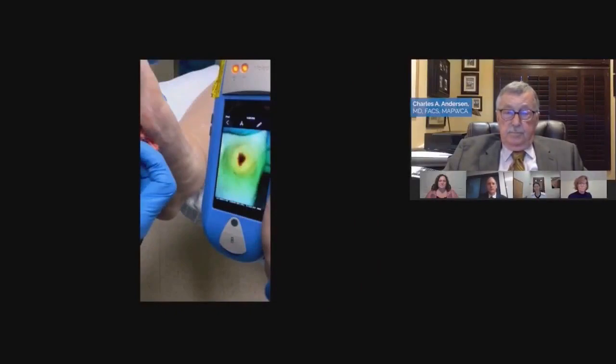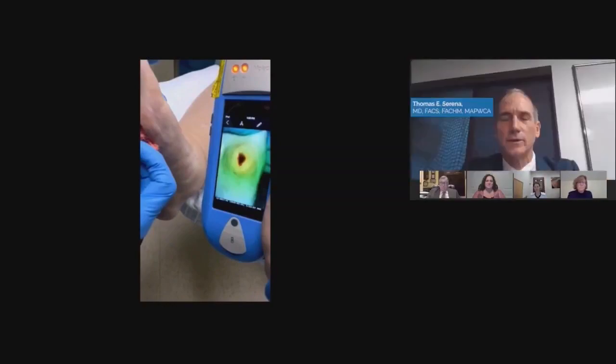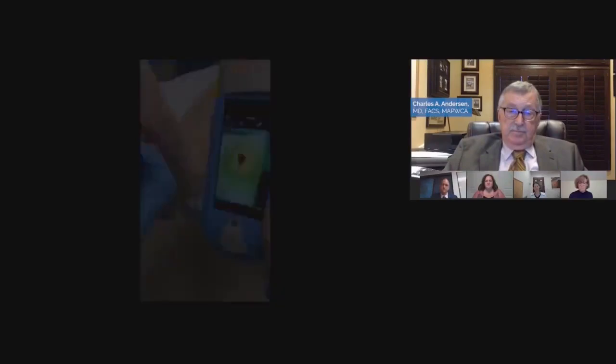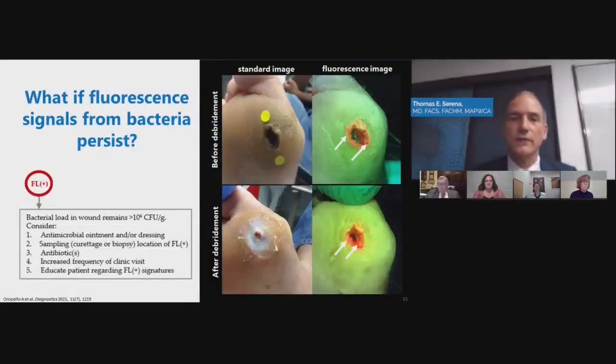That's a terrific video, Chuck. Did I see you using it in video mode as well? We do at times, and it's something that is very easy to do, and we can actually watch the results of the debridement as we're doing it. What if fluorescent signals from bacteria persist? Jenny, you have some experience with this.